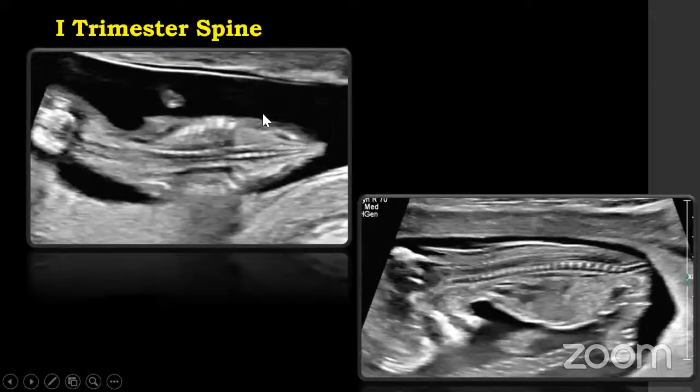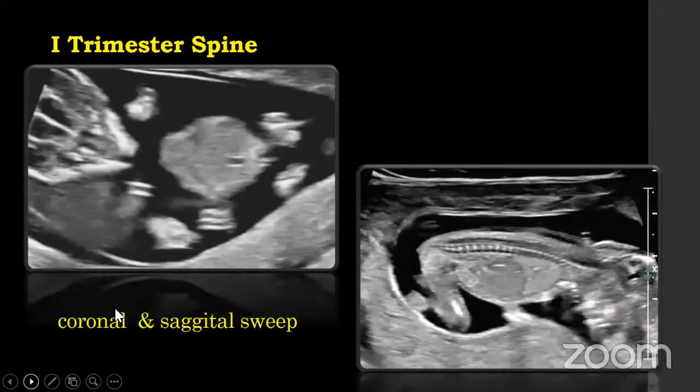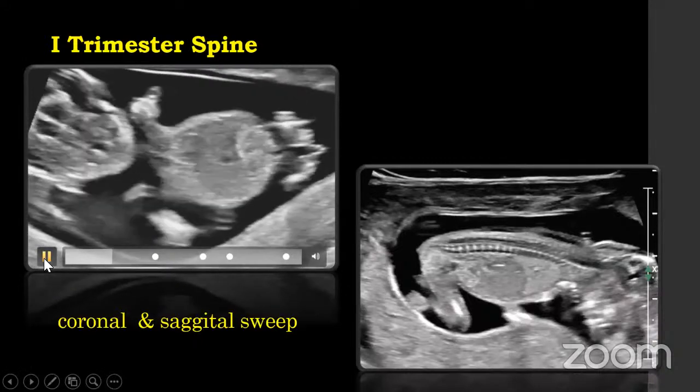Now coming to the spine. The spine is again seen both in the first and second trimester. In the first trimester, you can appreciate the spine in both coronal as well as sagittal sections. What we appreciate in the coronal section is that there is no lateral angulation or scoliotic deformity. There is tapering of the spine. And on a sagittal section, we are seeing skin covering the spine. I am seeing vertebral bodies, and I'm more interested to look for the intact skin covering the spine. So I just take a sweep. I'm just taking a coronal sweep.